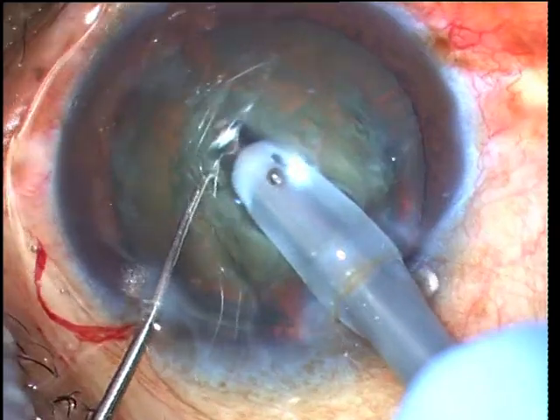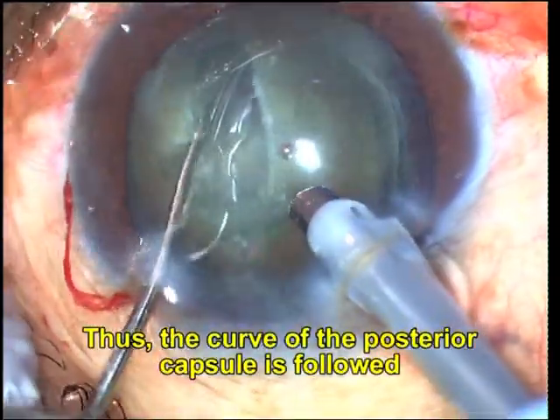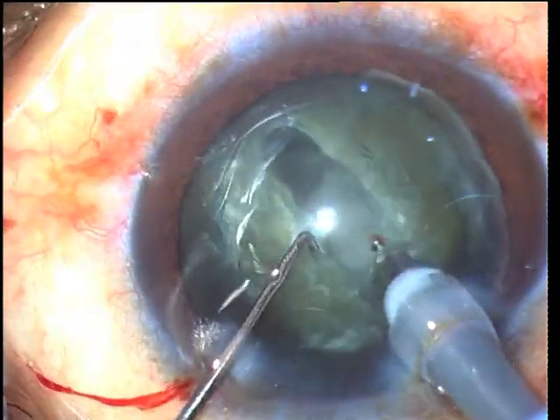Downslope sculpting followed by upslope sculpting once the center of the nucleus has been crossed is done to follow the curve of the posterior capsule and to avoid any rupture of the posterior capsule.